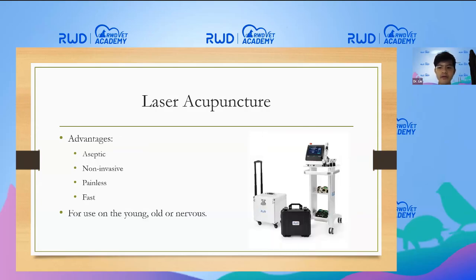In addition to needles, stimulation of the acupoints can also be triggered through laser. Low-intensity lasers can be used directly on the acupoint for treatment. In contrast to needle acupuncture, laser acupuncture is non-invasive and can be a more feasible treatment for animals. Typically, patients do not feel any sensations when a low-light laser is used.